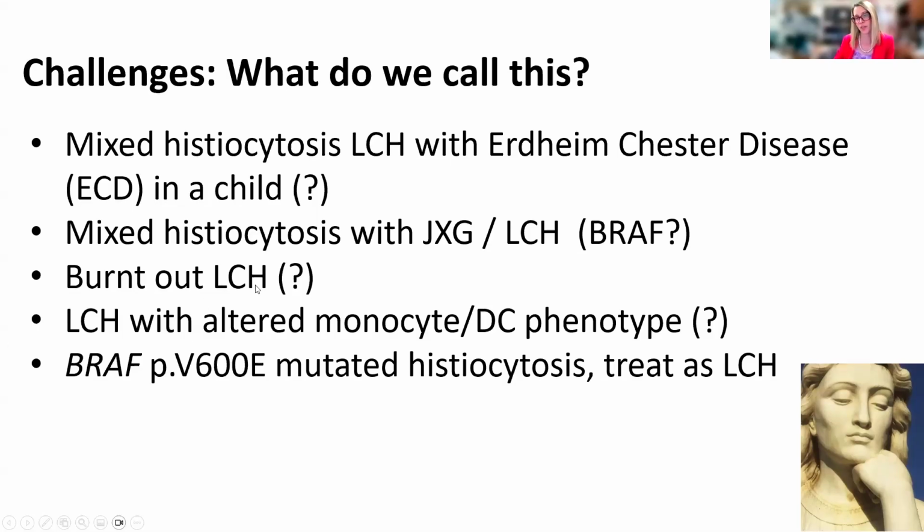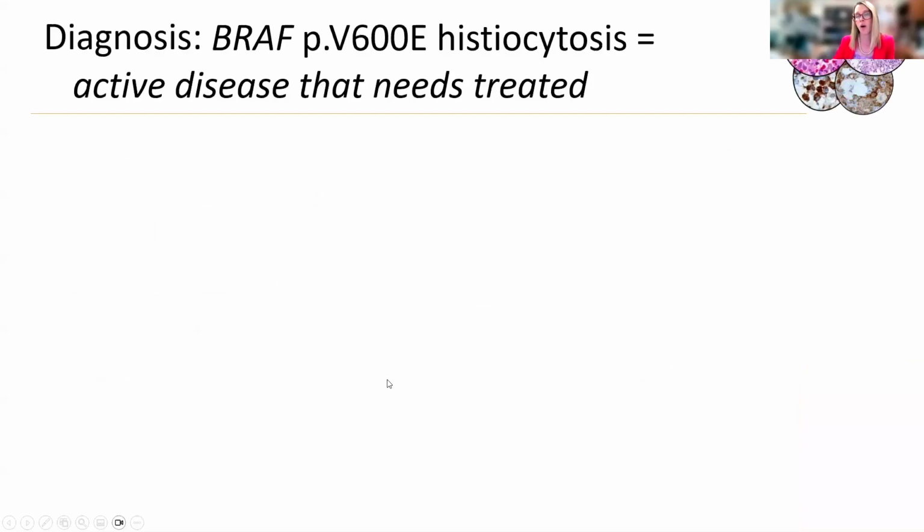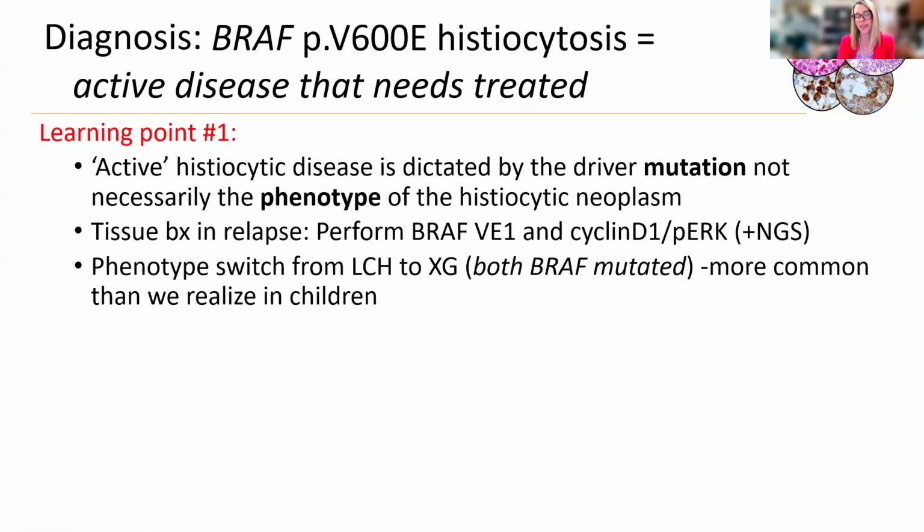Definitely would never call something like this burnout LCH, knowing that there's mutation in both populations. So I typically would call this a BRAF mutated histiocytosis, with the understanding that it has this mixed phenotype, and that really it's the driver mutation that we should be focused on, more importantly for the treating physician, as opposed to that phenotype.